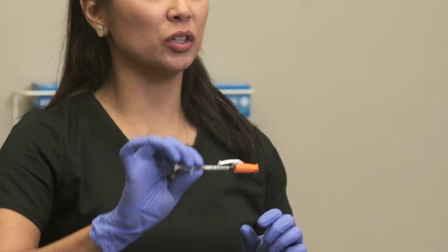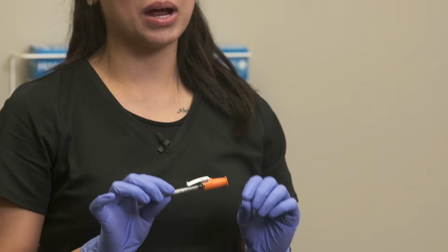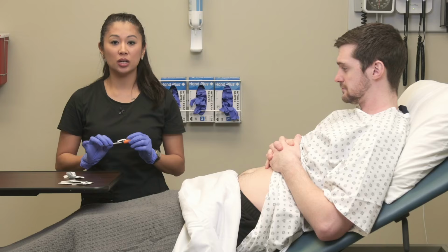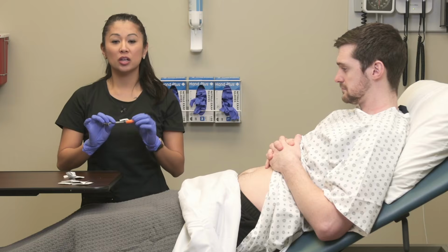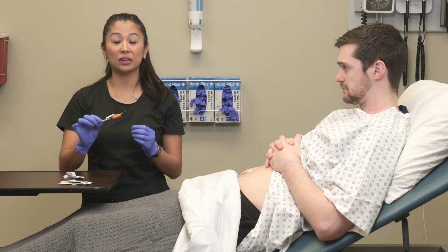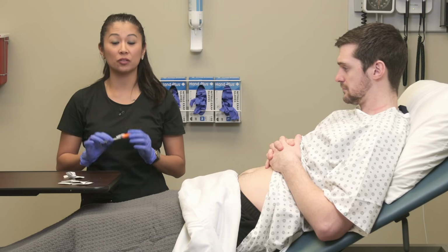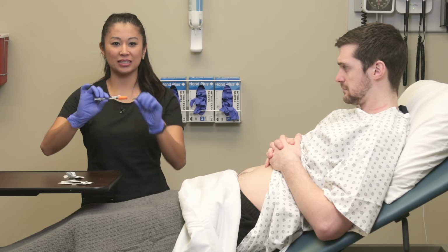Now this particular syringe I have in my hand, notice the orange cap. The great thing about this is it's universal for the sign that it's an insulin syringe. So you should only have insulin in an insulin syringe. It's a little bit different in that it is counted in units when you give insulin. So again, it's really important to pick the appropriate syringe for the right medication. All right, so notice that orange cap, think insulin.